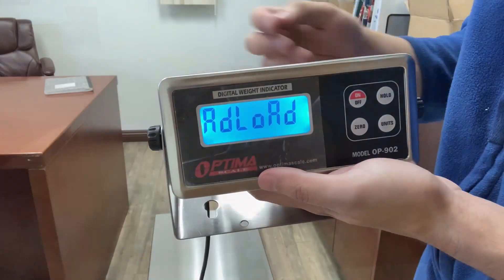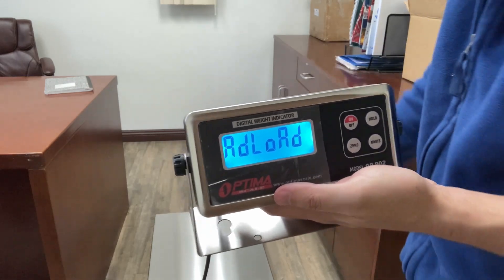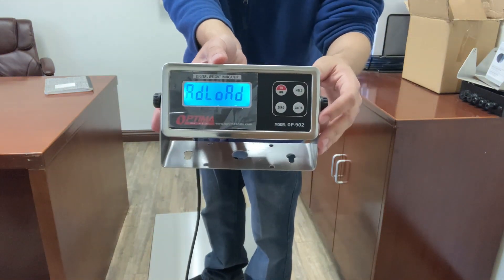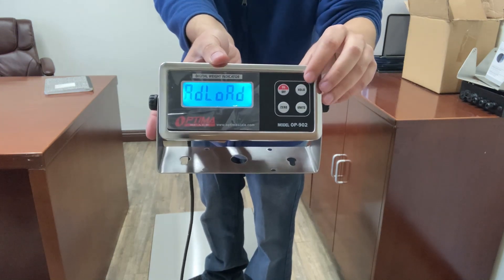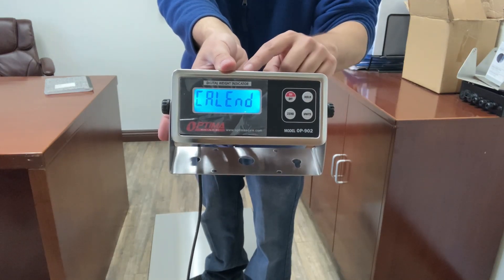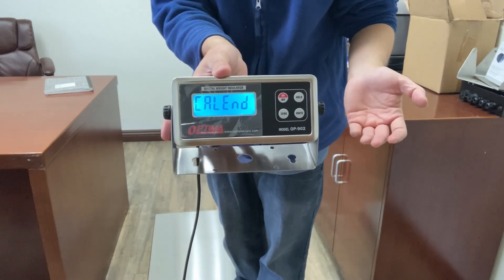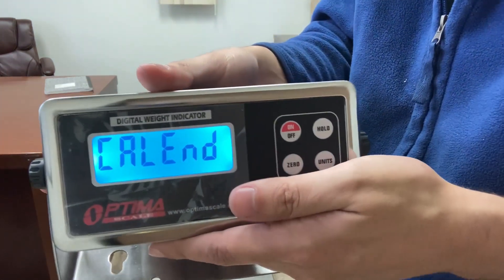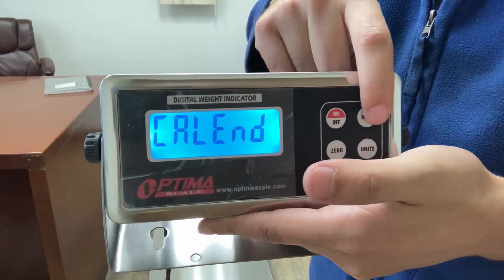Now you see add load. If you're using a non-NTEP floor scale or a VET scale, this is where you put your weight on it right now. So I'm going to stand on it. You'll still see add load — whatever weight you're going to put on it, this is where you place it. Press the hold button and you'll see cal end. That means calibration is now done. Now remove your weight — in my case I'm going to step off the scale. Cal end — make sure nothing is on the scale, everything's clear. Press the hold button.